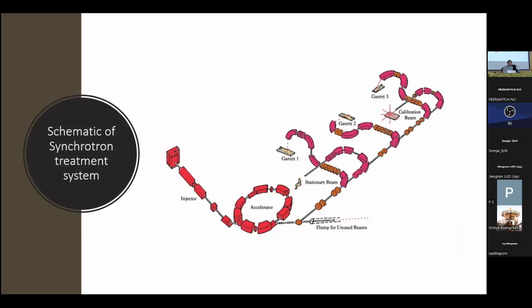For therapy, here's a basic layout for synchrotron systems. So you have your source, which we'll talk about in a bit, and your injector. These are components that you need. Every single synchrotron-based facility is going to have some version of each of these components.